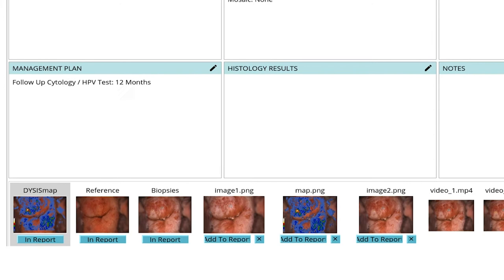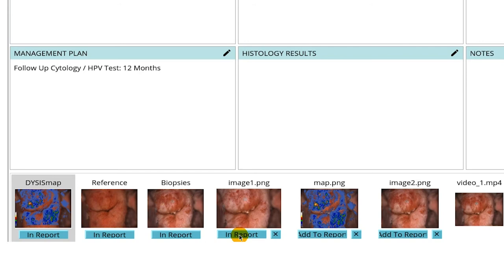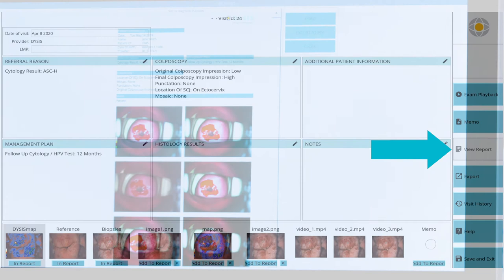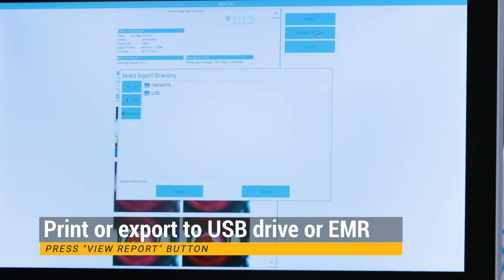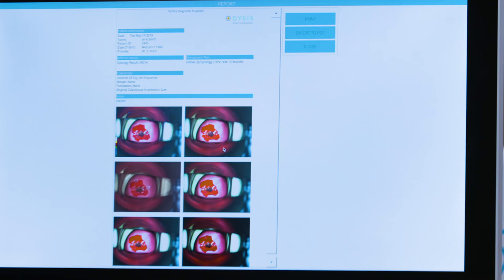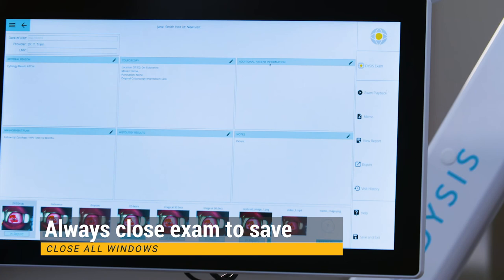Press the View Report button and select Print if configured for a printer or Export to PDF to save the report to a USB or EMR. This can be done at any time following completion of a Dysys exam. Close all windows until you are back to the Dysys main menu to save the exam.